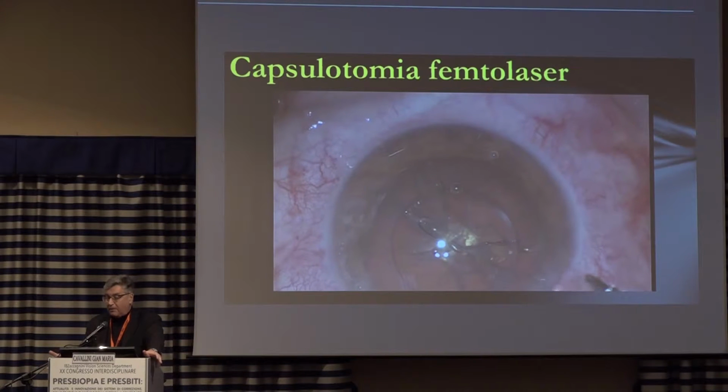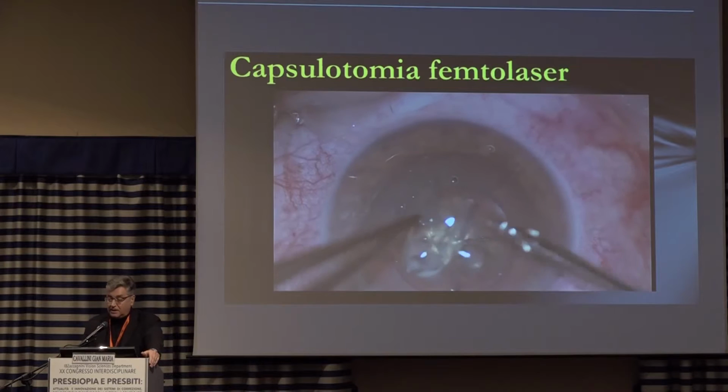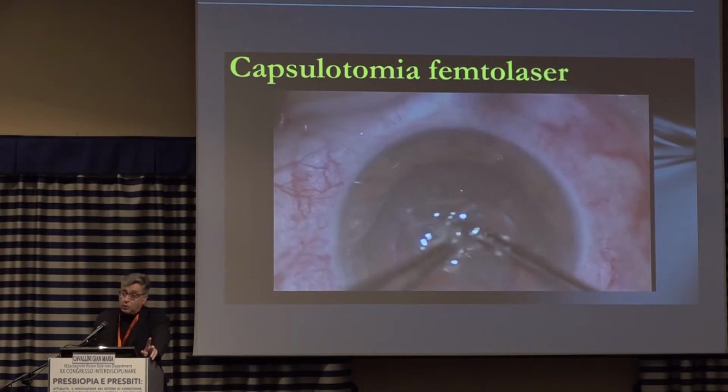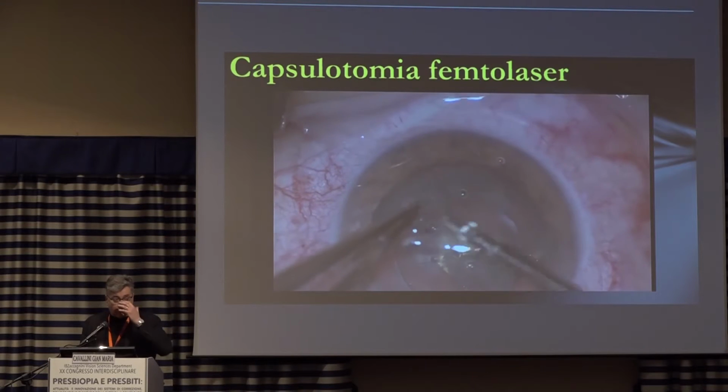This is capsulotomy, when you remove the capsule after femtolaser surgery. It's very easy and quick to do. You have to be careful because bridges may form.